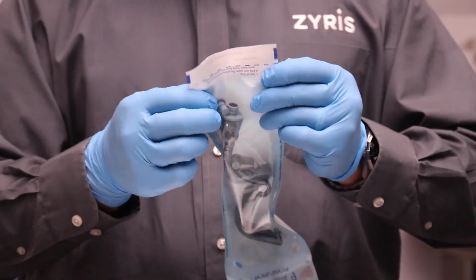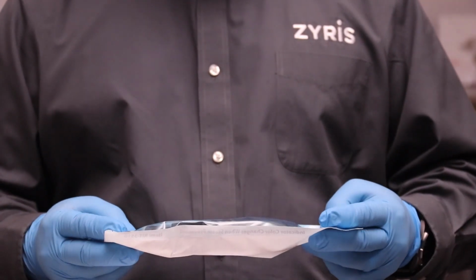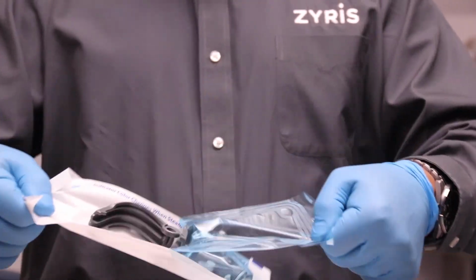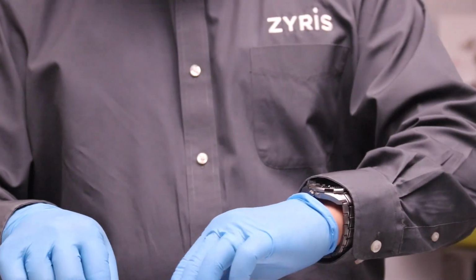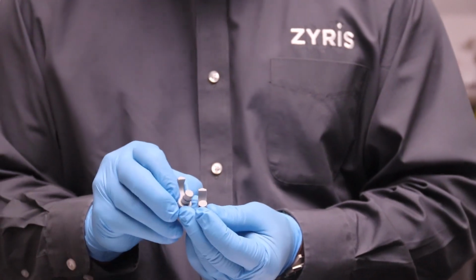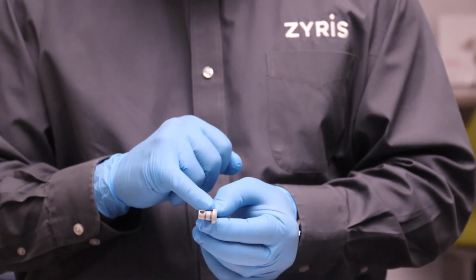Once it's placed in there, after it's done, in order to use the control head again, it needs to be reassembled. So once it's through its autoclave cycle and it's ready to be used again, remove all four components from the autoclave bag. The first thing that you want to do is look at the two levers to ensure that they're in good condition. The lever will have either an R for right side or L for left side. Be mindful of that. In addition, each of the levers has two O-rings. Those O-rings need to be inspected to ensure that they're in good condition.